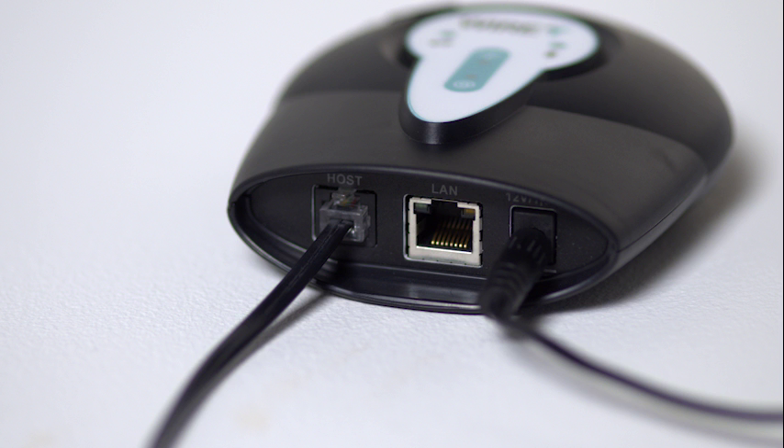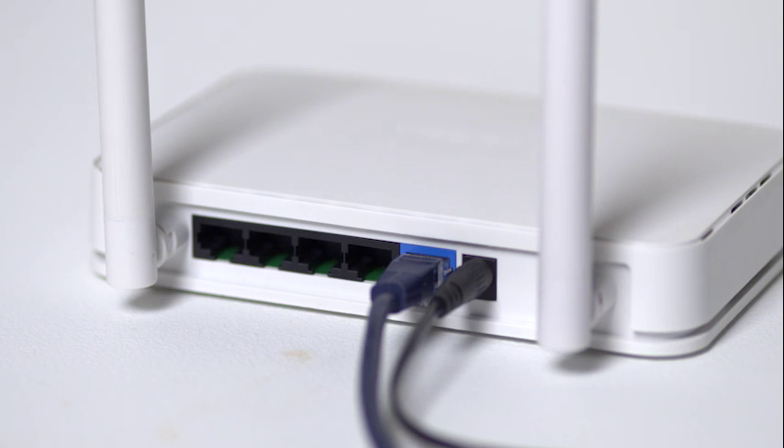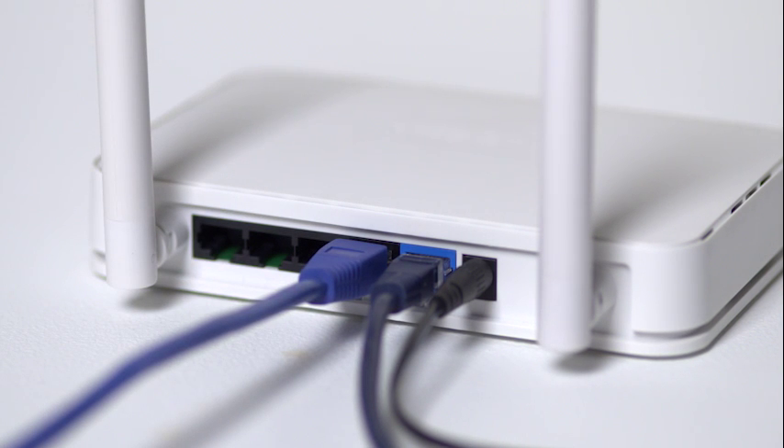Next, we'll connect your internet accessory to your home internet router. Plug the ethernet cable into the internet accessory. Plug the other end of the ethernet cable into an available port on the back of your router.